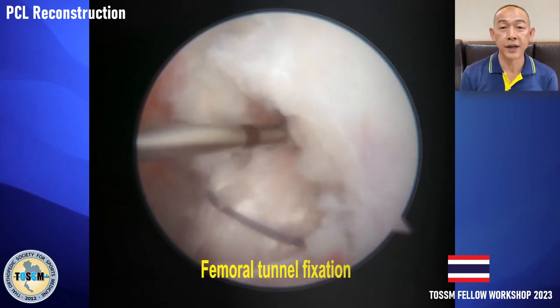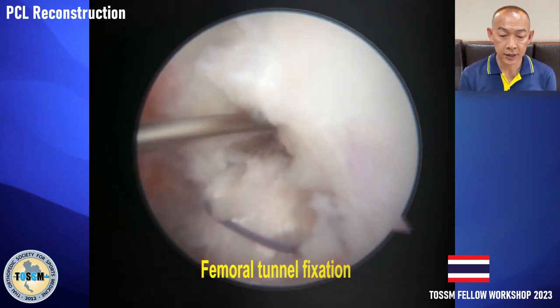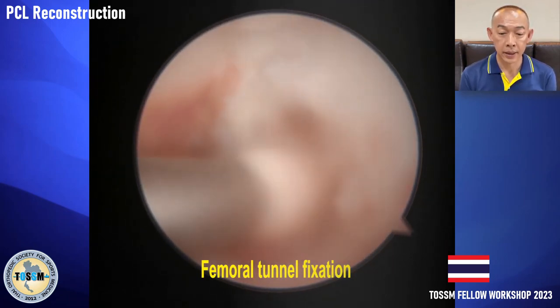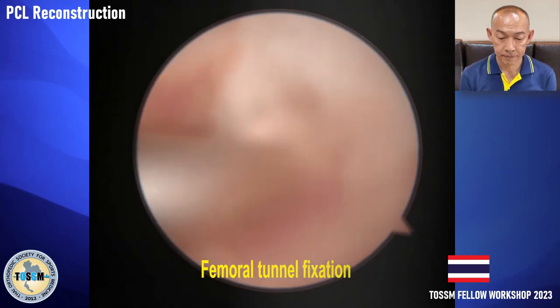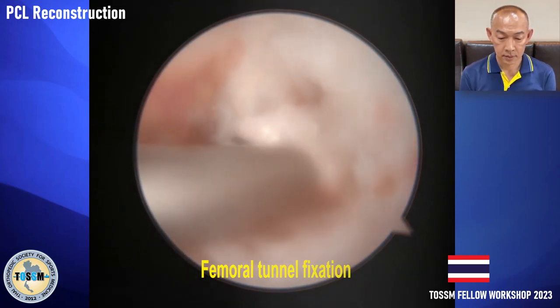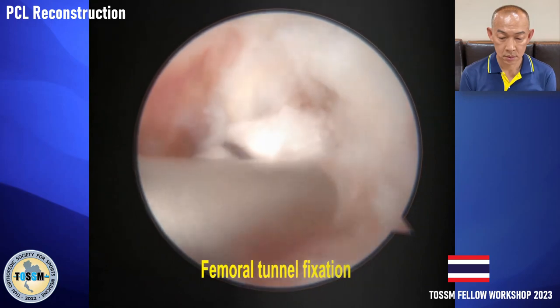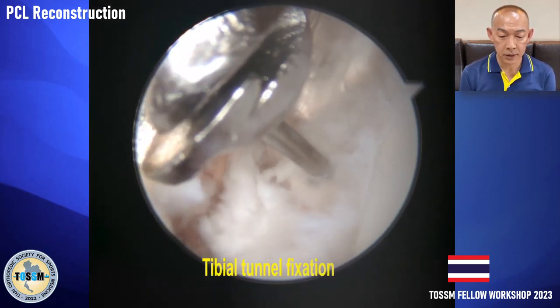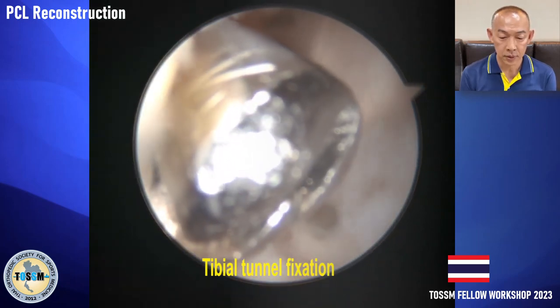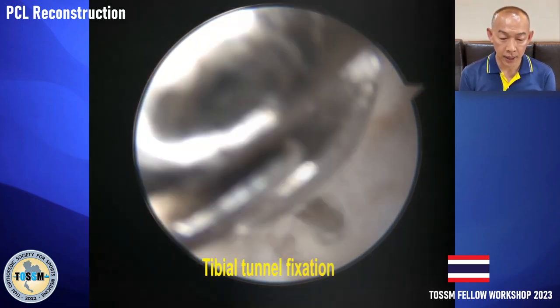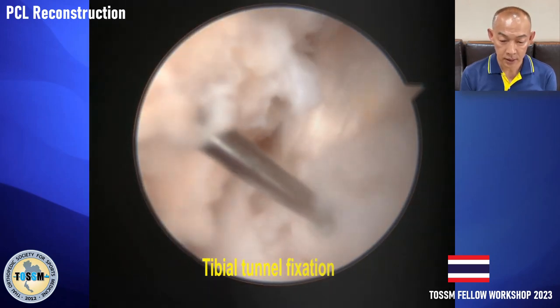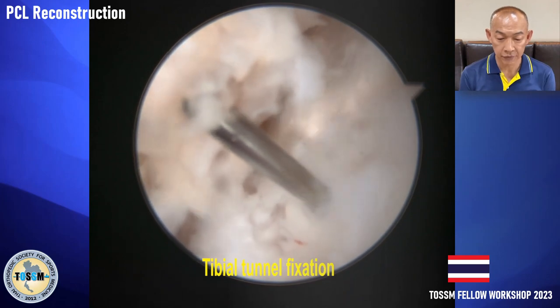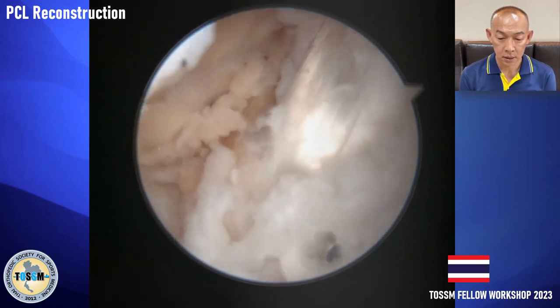We perform fixation starting with the femoral tunnel first, using an endobutton and a bio-screw. Finally, we fix the tibial tunnel with aperture fixation using a bio-screw over the guide wire. You can see the tip of the bio-screw at the aperture fixation site and the PCL graft in place.